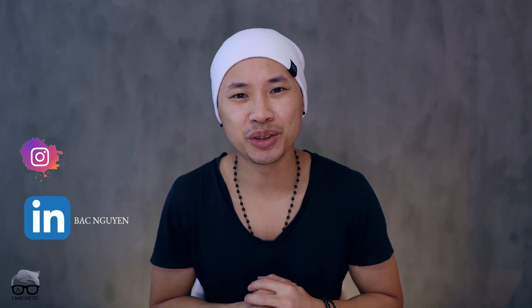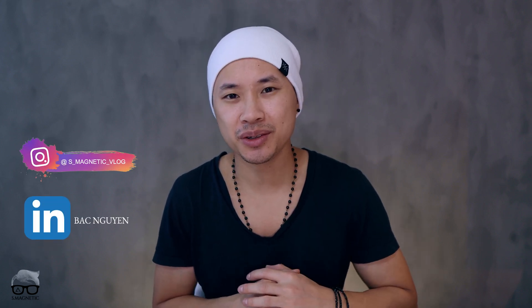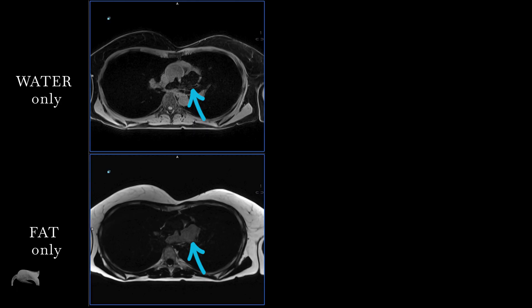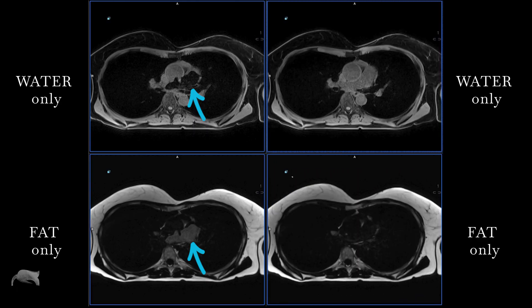Hey, what's up? Welcome back for another 2 minutes tips and tricks video. So today we're gonna talk about Dixon swap artifacts. We're gonna go from this to this with one single step. Let's go.